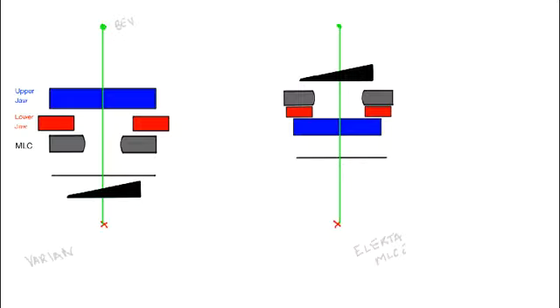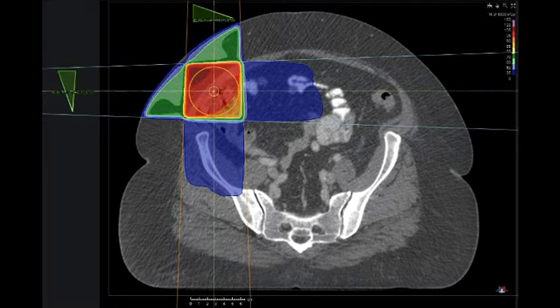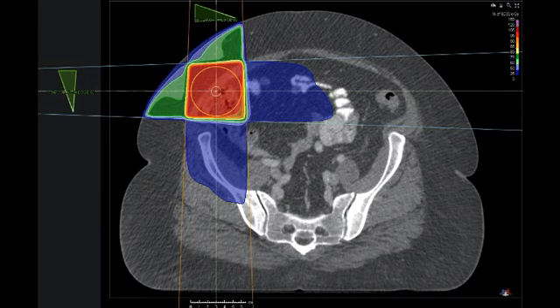So let's go back to this planning problem that I started out with. And you can see here, it should be pretty obvious how a wedge might be used. So here we go, let's put them in. So here is your two wedges, and you'll see that they cool off the beam in the heel part of the wedge and give you a much more even dose distribution. Actually, this was a little bit under wedge. This was a 45-degree wedge, and I found when I was playing with this particular plan that a 55-degree wedge worked best. So here it is. Wedges have many different applications, and you'll explore some of those in the problem sets.